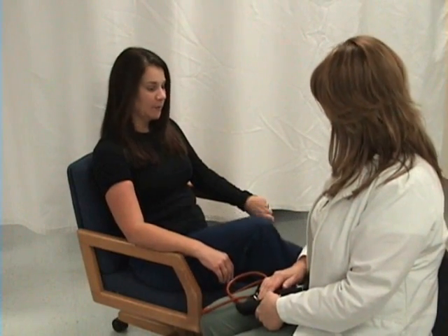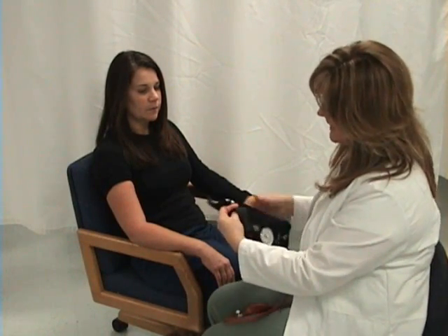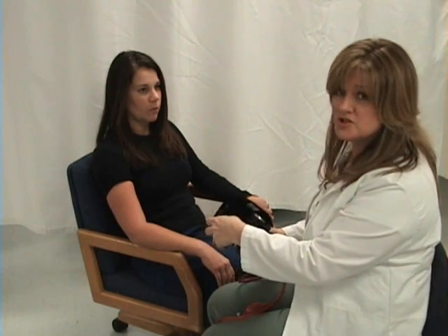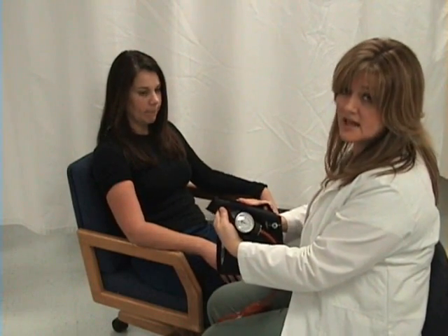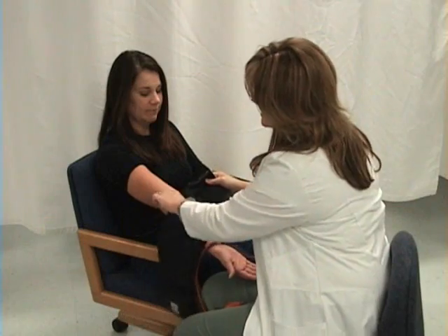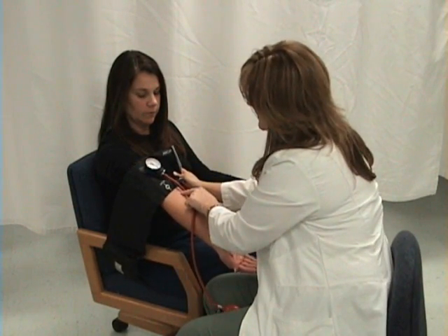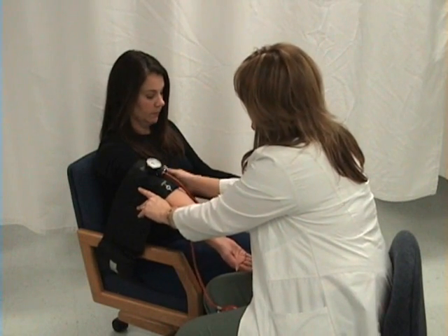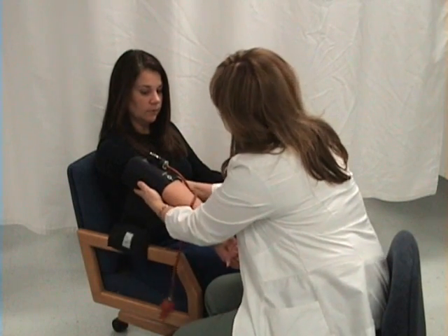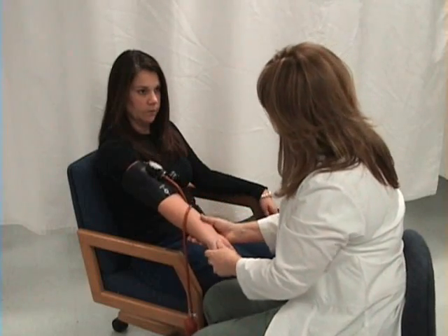Now I'm going to take my patient's blood pressure. The first thing I note is that her legs are crossed — I need to ask her to uncross them. Now I'm going to put the blood pressure cuff on her arm. Make sure that the cuff is the correct size for your patient. You want it to wrap around your patient's arm and all the Velcro should be meeting Velcro. You shouldn't have a lot of overlap, and if it's too short, it's not large enough. Notice that her sleeve is pulled all the way up — you never want to take blood pressure over clothing. There's a line that says artery; I want to line that up with her brachial artery so that I get a correct reading.